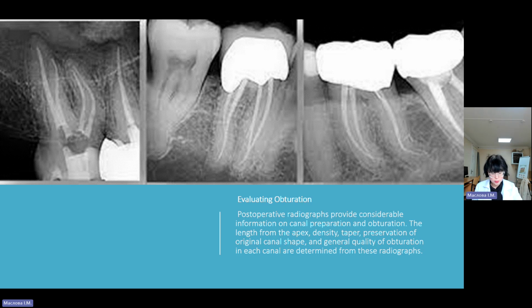The use of digital radiography is becoming more common in dentistry, although there are technical advantages over conventional approaches. The same limitations apply. Overall digital radiographs are equivalent to conventional radiographs with regard to diagnostic and treatment-related accuracy. These factors and other considerations are discussed.